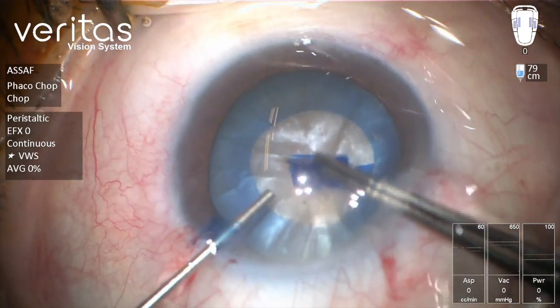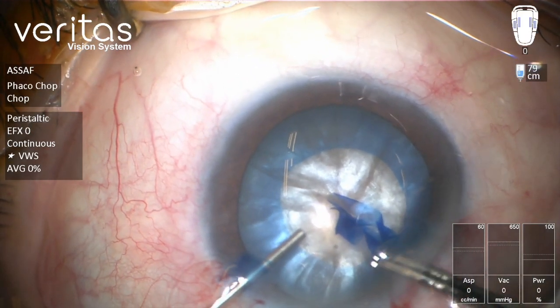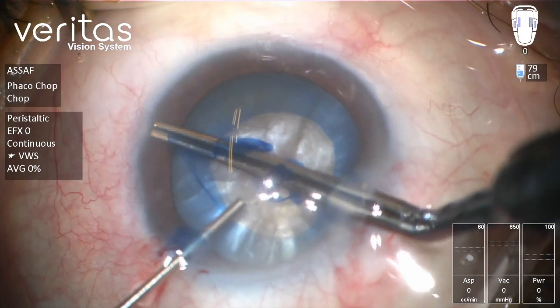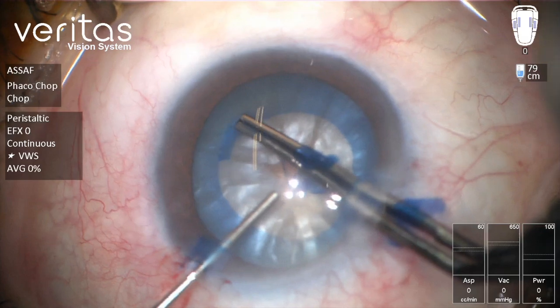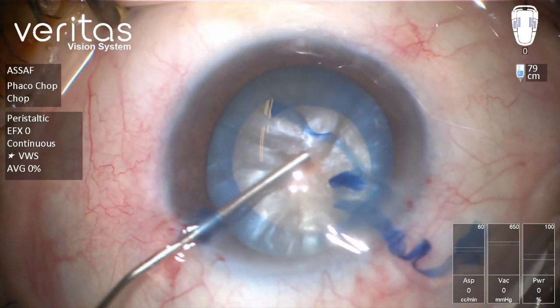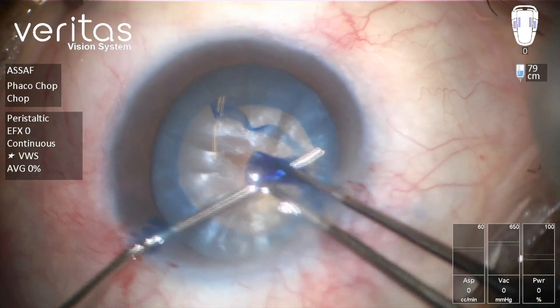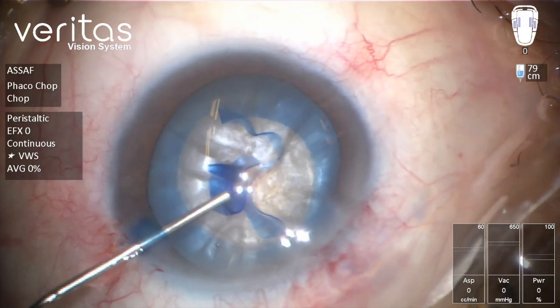I'm now going to close this rhexis — it's about a five millimeter rhexis, or maybe a little less. We can enlarge it a little bit more. This flap might cause some tension on the side of the tear, so I'm trying to keep the flap in the center. Maybe we can inject some OVD to pressurize the anterior chamber.